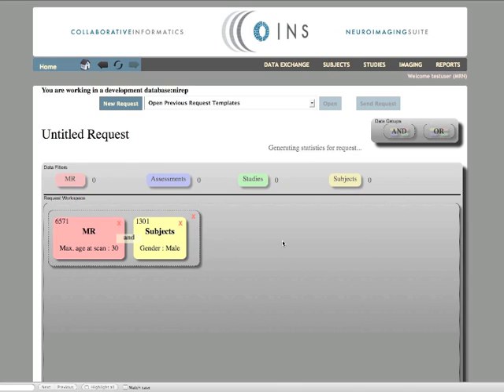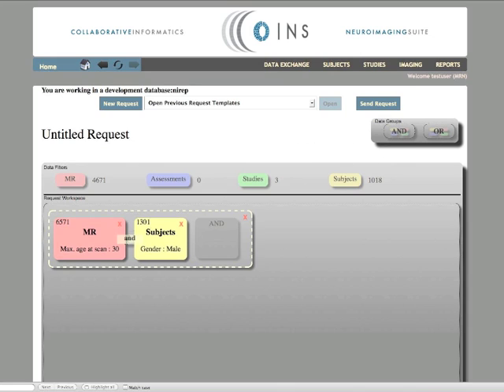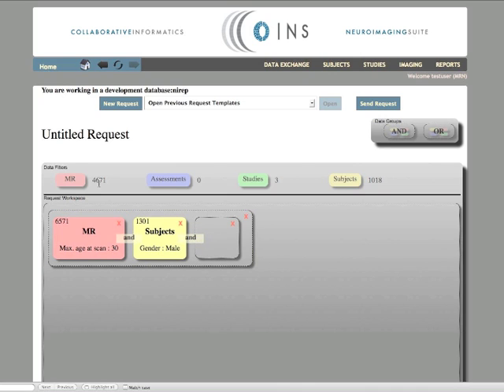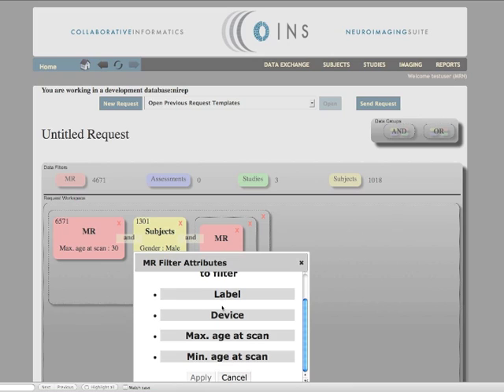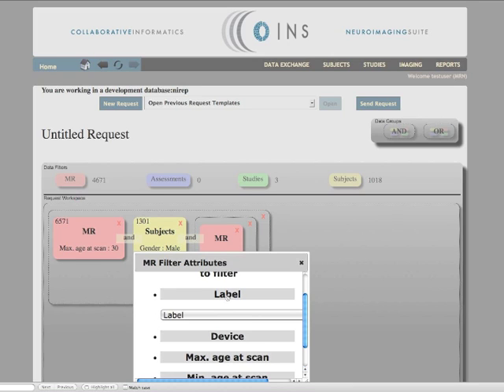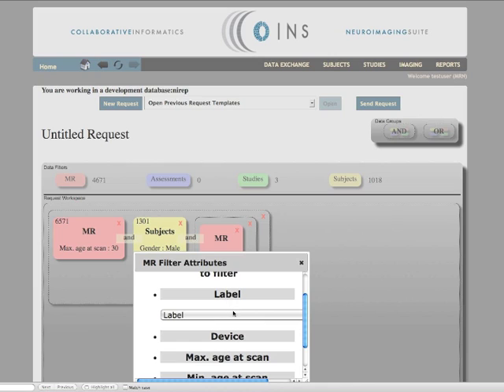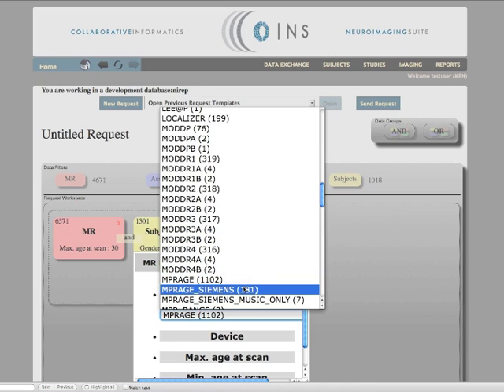Next, for reasons that will soon be obvious, I drag an OR group into my existing AND group. The next step is to filter out only MPRAGE data. When we examine our choices for scan protocol labels, we see that there are several choices which indicate an MPRAGE sequence was collected.